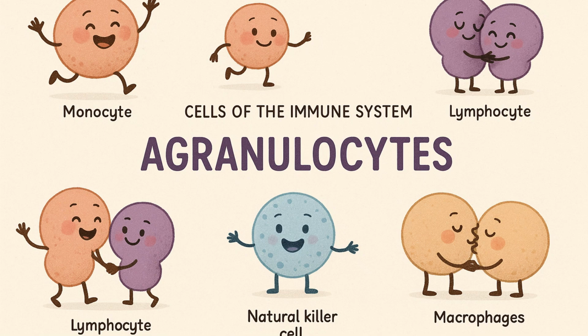I'm excited to share with you an important topic in hematology and immunology, agranulocytes. Today we will explore what these cells are, their different types, and how to identify them under the microscope. So let's dive right in.